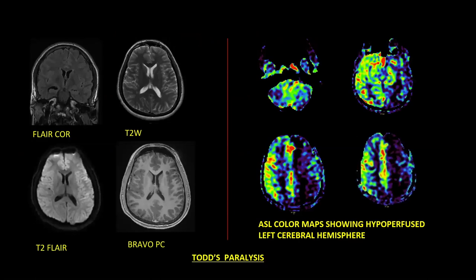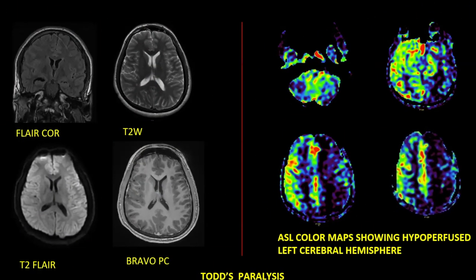Here we see a 21-year-old patient who presented with acute onset right-sided weakness. On diffusion, there was no area of restriction to suggest hyperacute or acute infarct. On FLAIR images, however, there was relative hyperintensity in the left cerebral hemisphere. ASL color maps clearly showed hypoperfusion in the left cerebral hemisphere, in keeping with post-ictal change. This was a case of Todd's paralysis. The patient was followed up at a 24-hour gap and this hypoperfusion reverted back to normal.